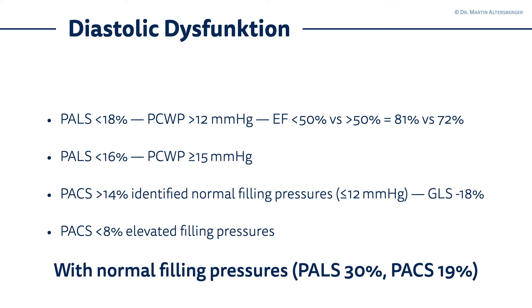Combining all measurements, we are relatively sure that filling pressures may be normal in this case. Diastolic dysfunction is a puzzle and we have to put together all the pieces. Left atrial strain, with the knowledge from current literature, can help identify normal filling pressures — even in patients with a reduced global longitudinal strain but preserved ejection fraction. Even though the global longitudinal strain is reduced, we can be quite sure that filling pressures are normal using measurements of peak atrial strain and peak atrial contraction strain.